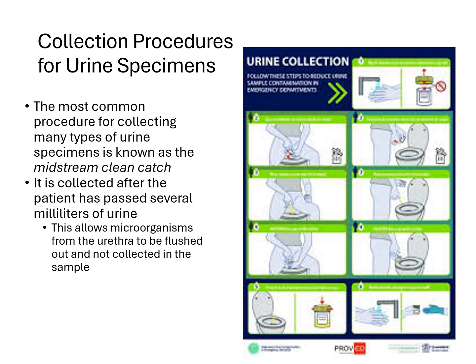So that's why it's important to make sure they follow the collection procedures, because the urine itself should be sterile, but when it comes out and gets contact with the outer urethra and stuff, that is when it can become contaminated and may actually skew results.